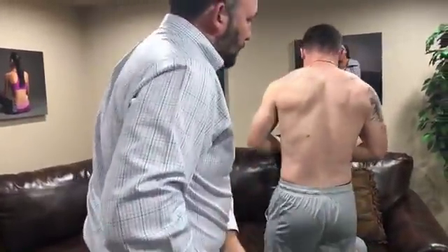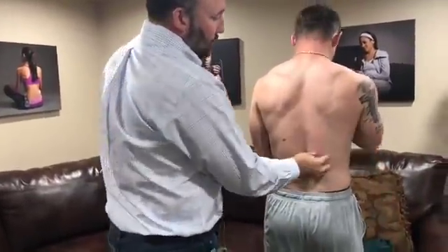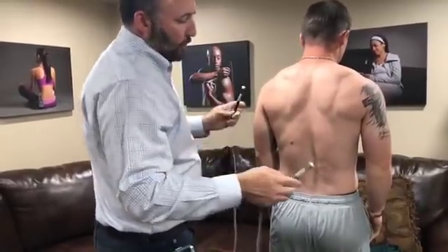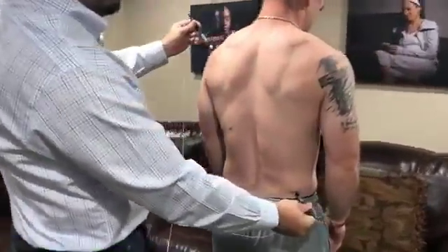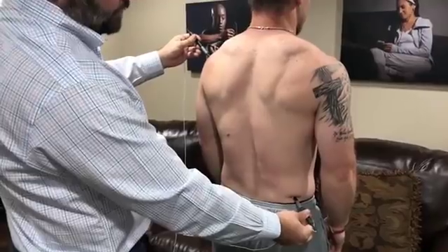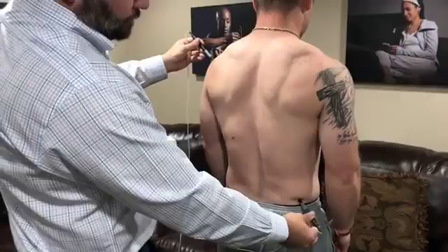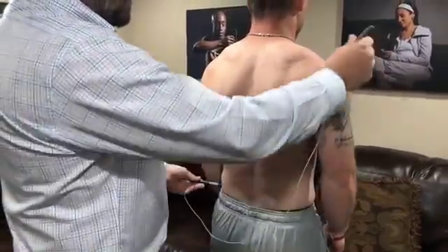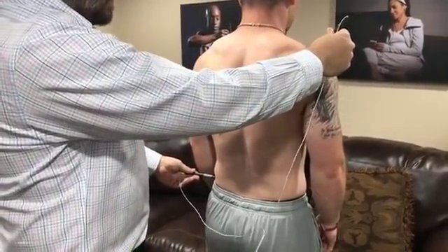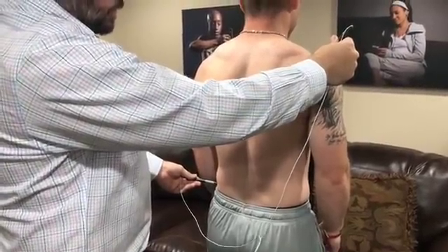We're going to pick a location with Travis — we'll think he's got some pain on the right side just at this level. You don't have to know vertebral levels or anything like that if you just know where his pain is. Again, our first step is a large X — we're going to go from hip to shoulder, directing the current right across that pain, 10 seconds, and then complete the X. When we treat the back, because it's such a large anatomical area, we do try to treat the entire muscle as well — the traps and the deltoids, wherever you're at, you want to treat the entire muscle as much as you can.